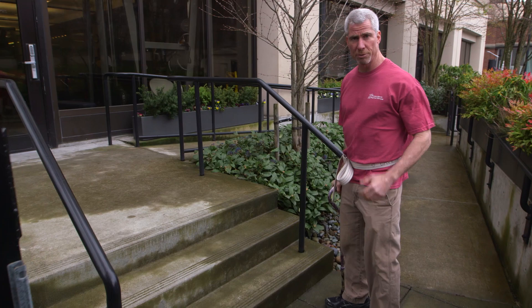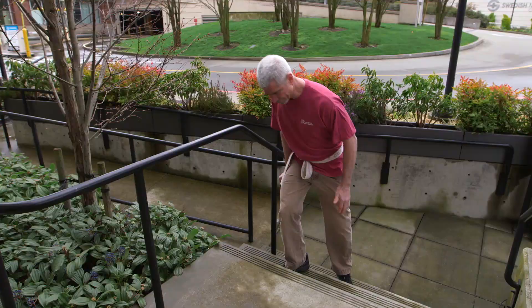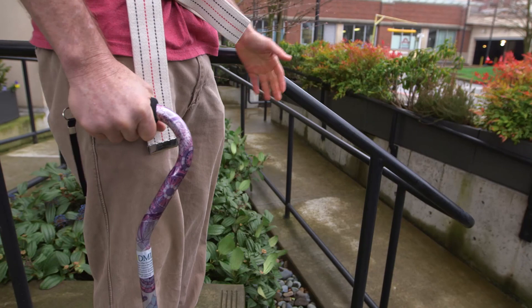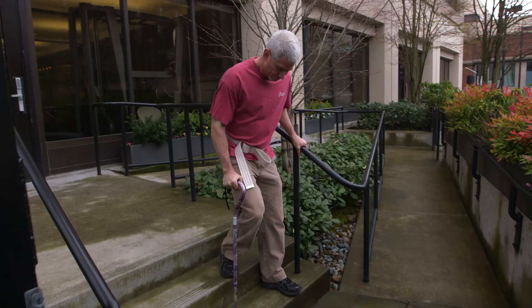When you get to the stairs, we follow a little bit of a heaven and hell motif. Good guys go up first — that means the strong leg, followed by the cane and the sore leg. If I have a handrail, I can use that. When I'm coming back down, bad guys go down, so that means the sore leg and the cane go first. I can use the handrail if I need to.